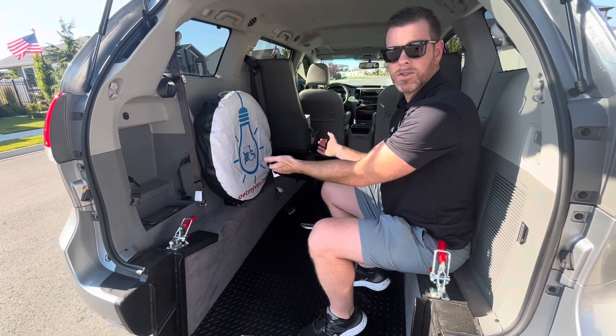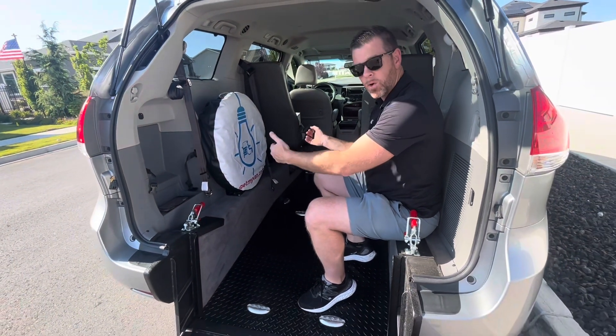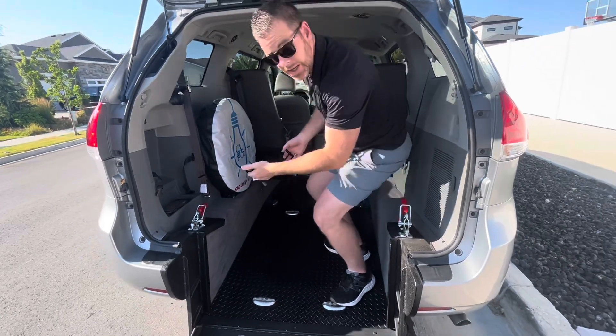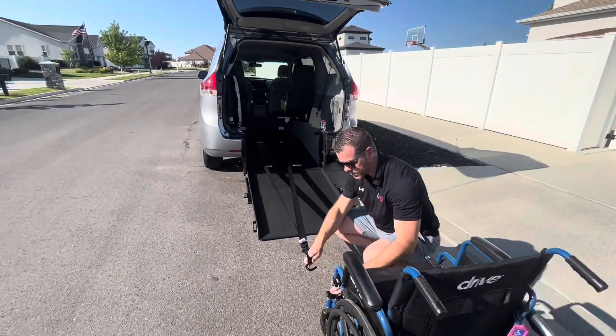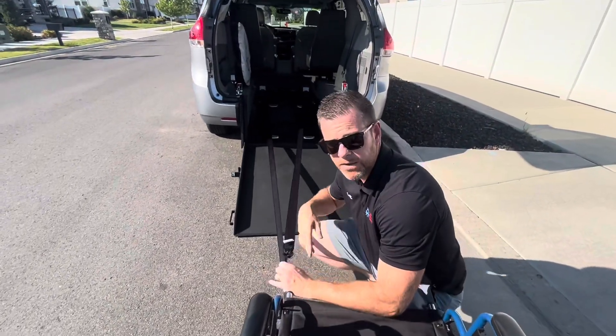The unique feature behind these Q-Straints is they pull all the way out to the back of the van, down the ramp, far enough out that you can actually secure them to your wheelchair frame before the wheelchair ever enters the vehicle.